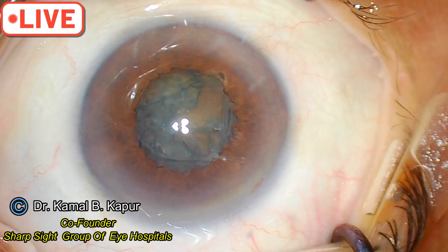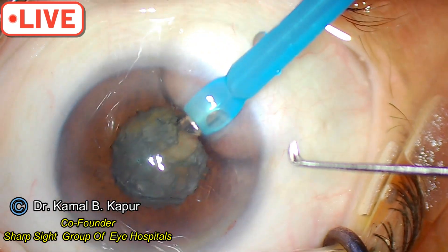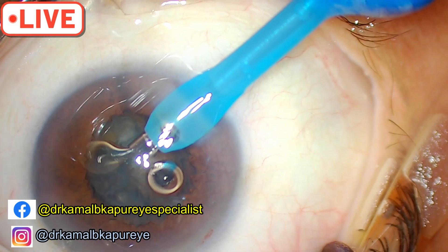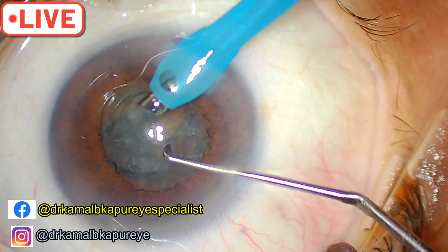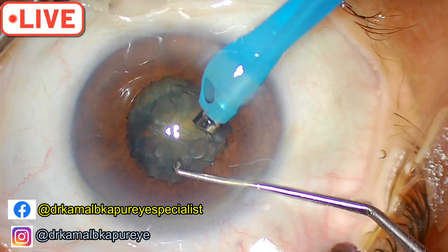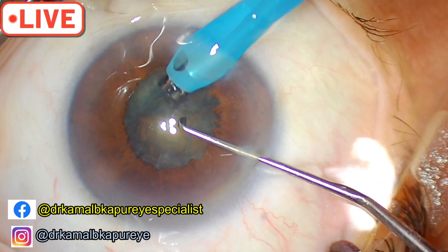Bevel downwards. Make sure you lift the lip slightly and enter in one go, then start your fluid. If you go in with your fluid on like a normal case, the iris will prolapse out. The next trick is to stay away from the edges of the sphincterotomy.